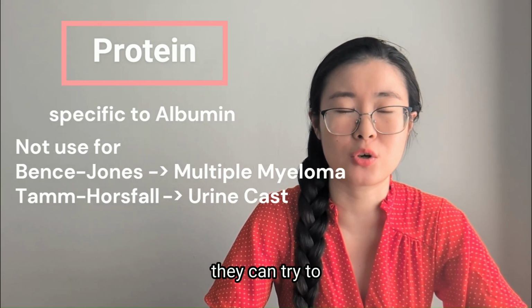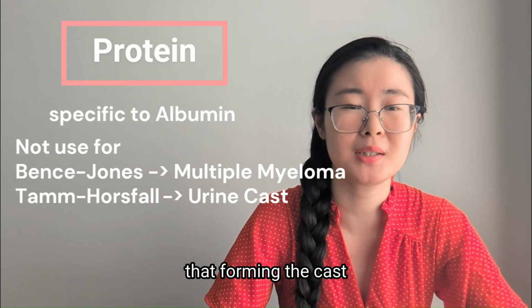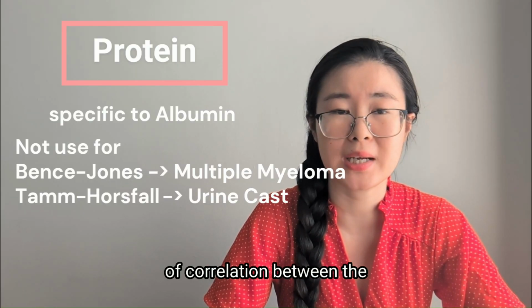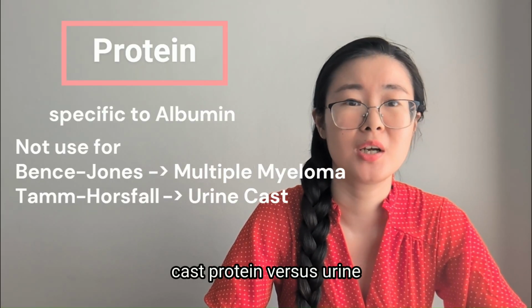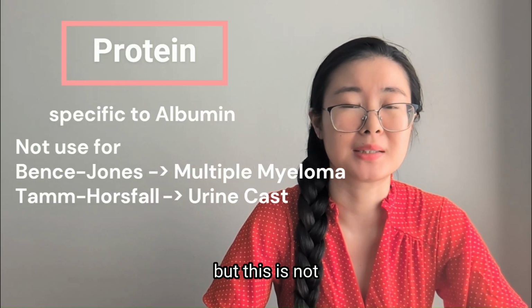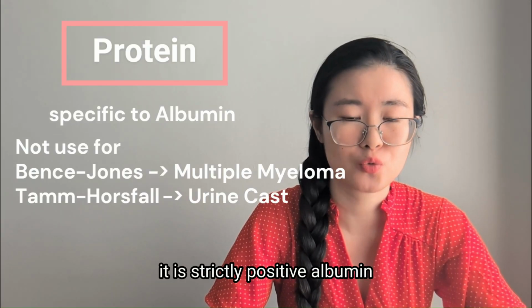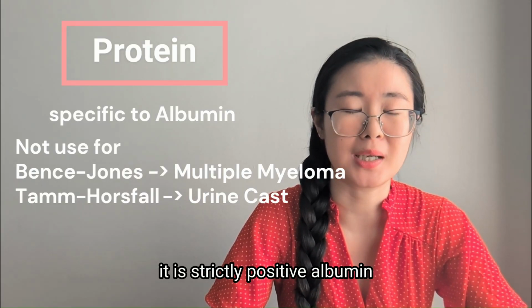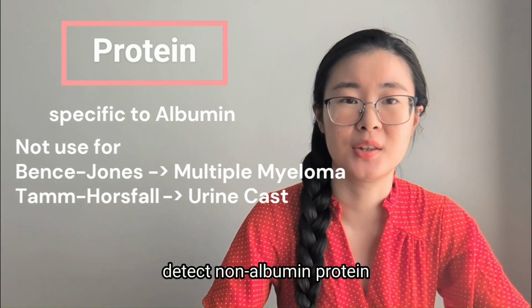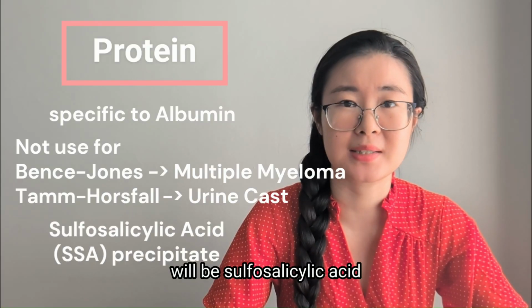And the other thing they can try to trick you with is the Tamm-Horsfall protein. It is uromodulin that forms the cast. Yes, there is some level of correlation between the cast protein versus urine protein or urine albumin level, but this is not a causation. Whatever you see on that pad, it is strictly positive albumin. It's nothing else.